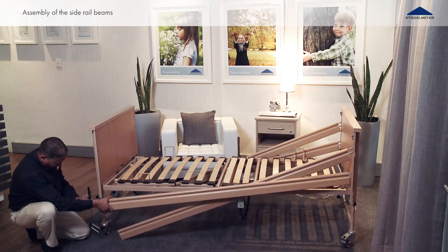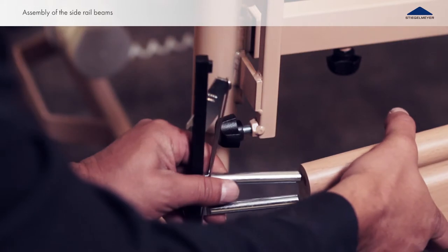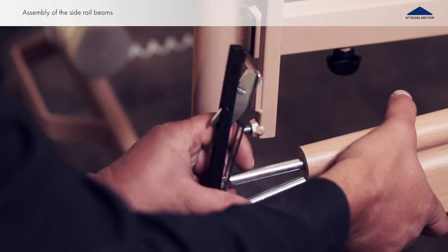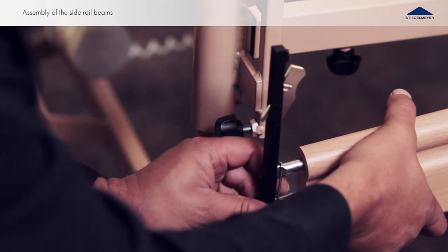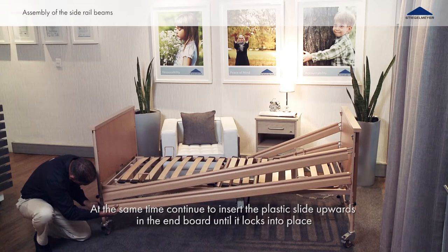As the plastic slide is being inserted, put the top pair metal pins into the upper side rail at the same time. Place the bottom pairs of the metal pins into the lower side rail.